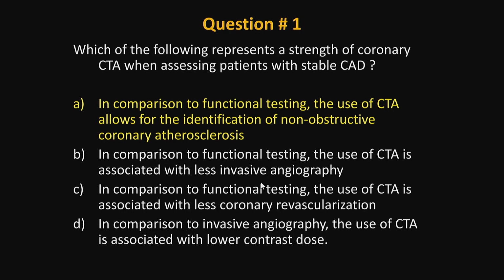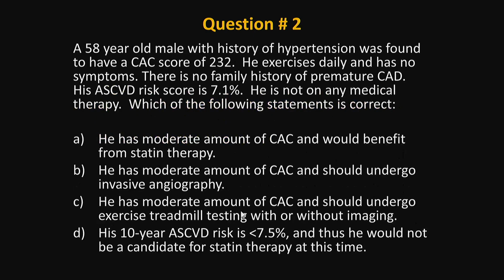In our talk today, I explained some potential reasons for this. And finally, invasive angiography and CTA tend to have a similar amount of contrast. If anything, invasive angiography, if only selective images are obtained, may be associated with a lower contrast dose, not CTA.